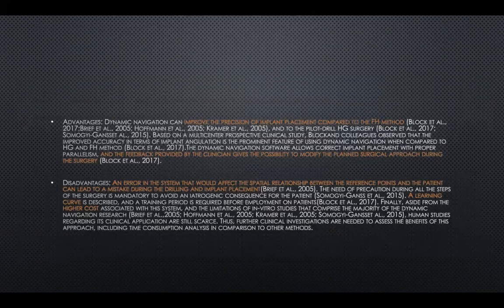So what are the advantages? The advantage is to improve the precision of implant placement compared to the freehand method. It also provides instant feedback during the surgery, and if you need to modify, you will have the liberty to do that.